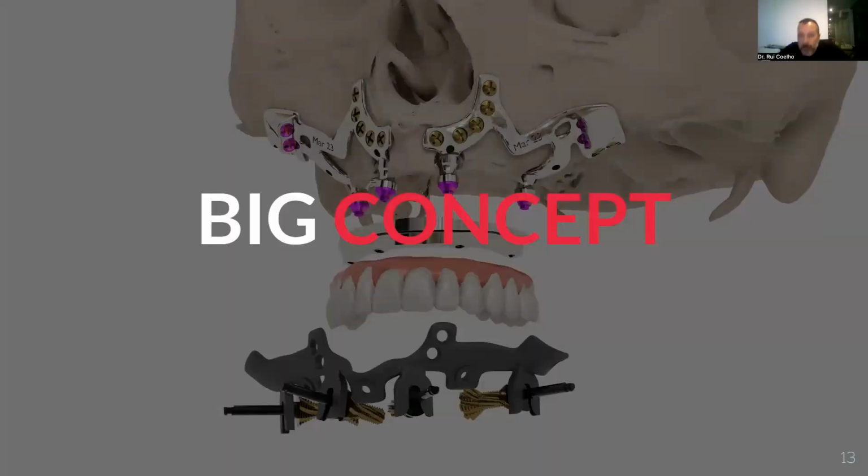So what is the big concept? First of all, we always go basal. This is one of the things. And going basal with special burs, if we have some type of alveolar process, we reduce it with this special bur with the help of a guide, of course, and we go almost to basal.